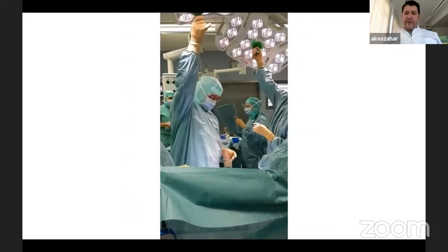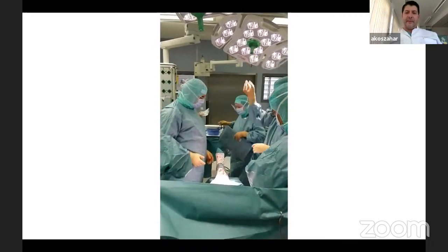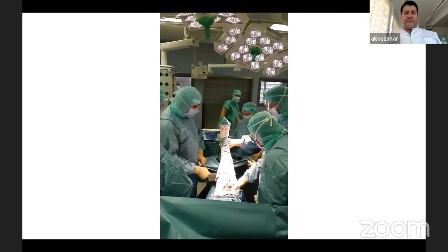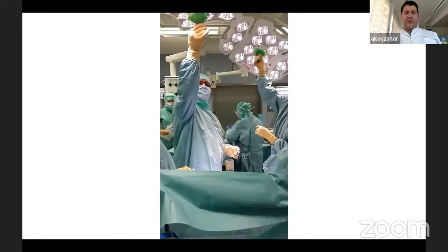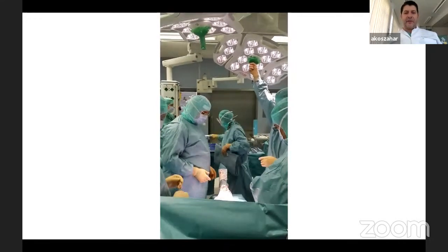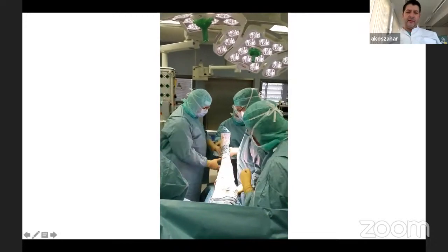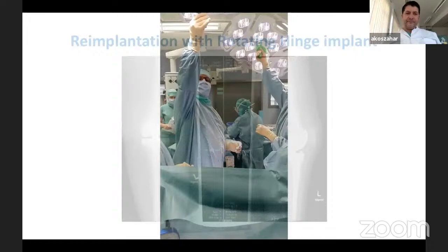As I mentioned, you go for a new setup. The one stage, sometimes also in the two stage, intraoperatively, you can change your instruments to clean instruments. You can do a redraping. You can change the lamp handles, the suction tips, and new gown, new gloves in order to minimize the contamination.